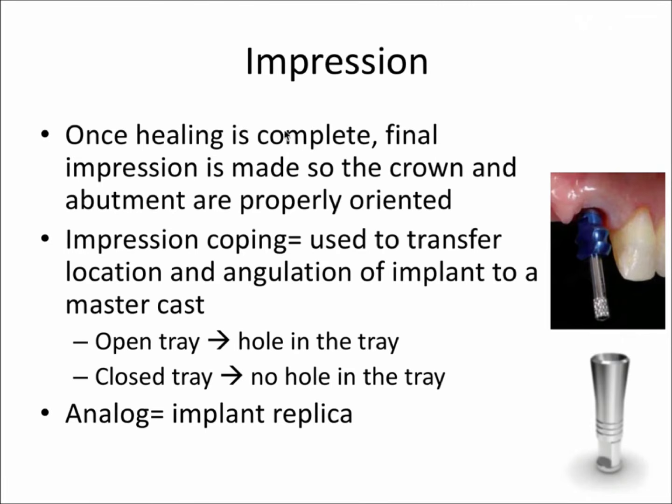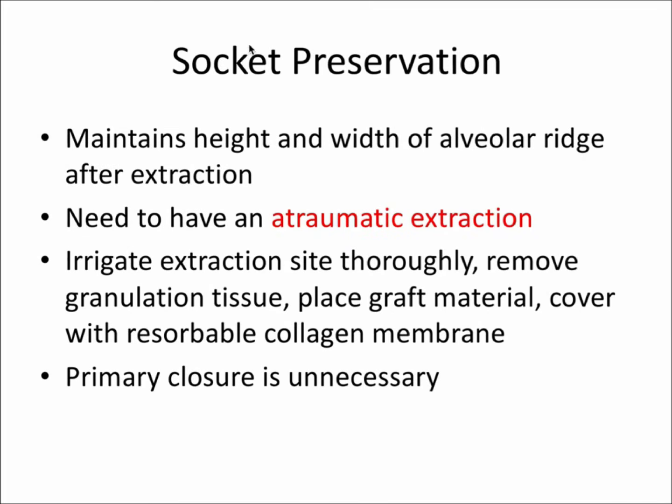So that's a very, very cursory overlook at implant impressions, just to introduce some of these concepts and terms. So socket preservation is something that we see in the oral surgery world, and this is to maintain the height and width of the alveolar ridge after a tooth extraction. So the most important part about socket preservation is to have an atraumatic extraction.